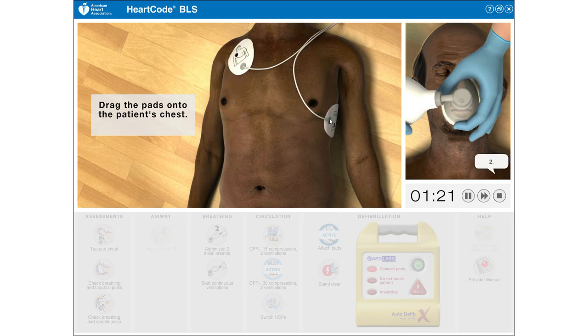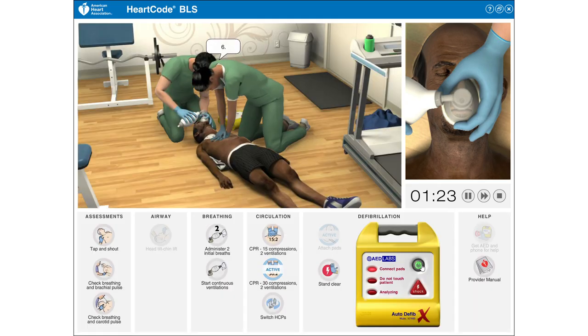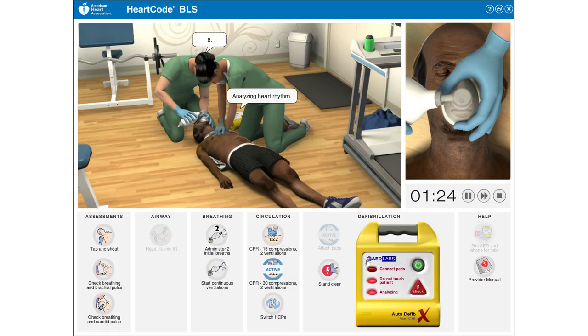Resuming compressions: 1, 2, 3, 4, 5, 6, 7, 8. Analyzing heart rhythm.